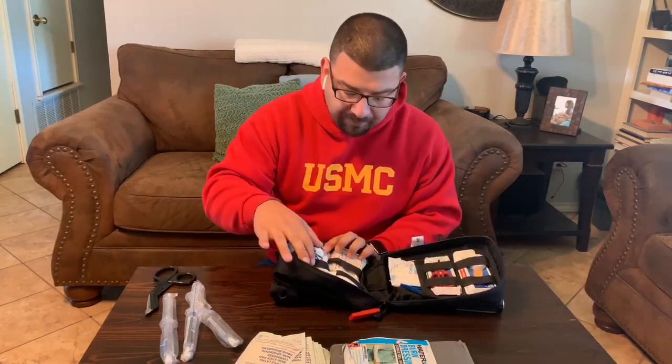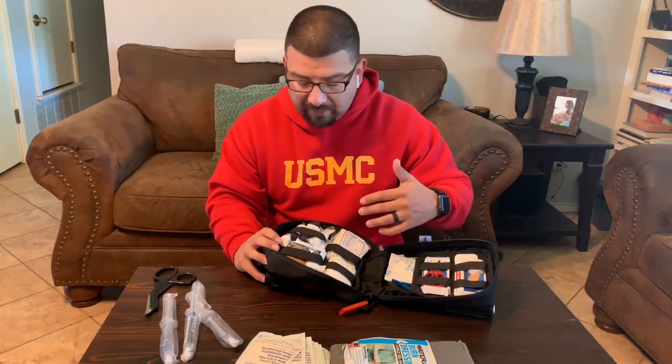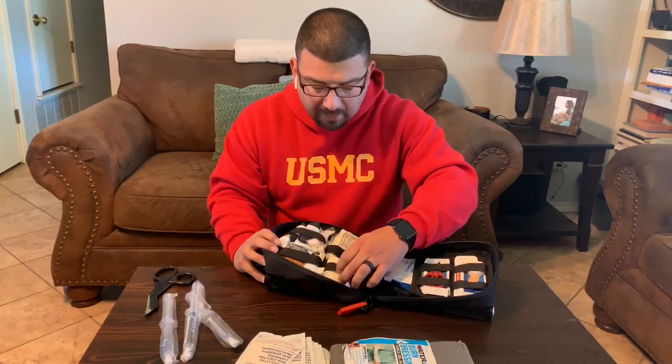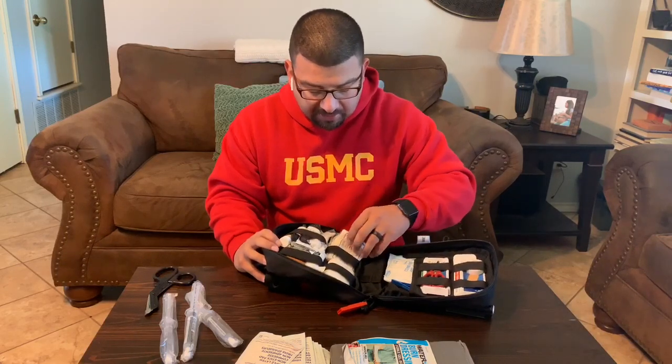Coming into the pockets here, again, I'm not going to pull every single thing out, just because I like the way everything is organized in here. But there's some more gauze right here, some more bandage tape. Here's your little gauze bandages, very thick.